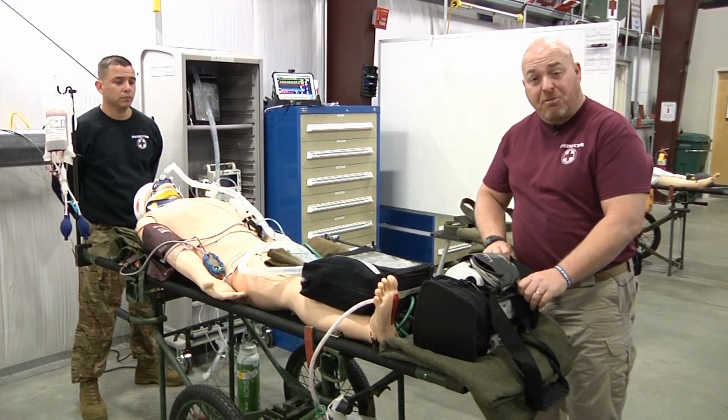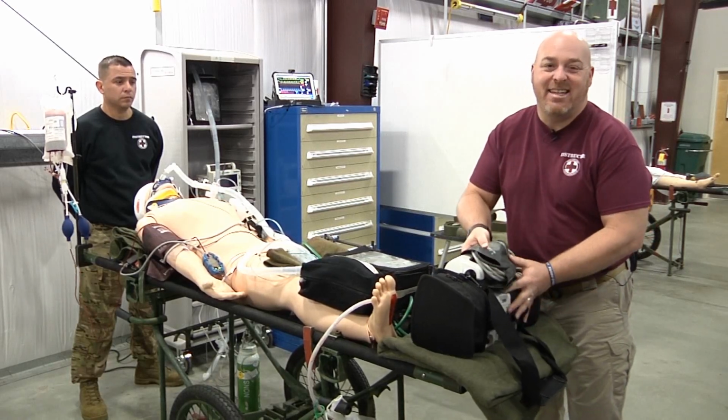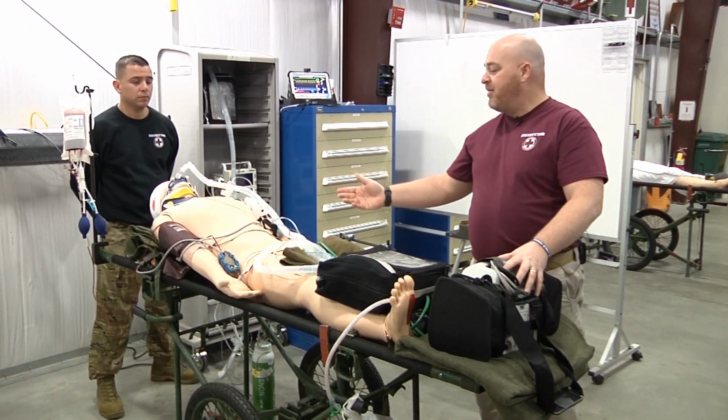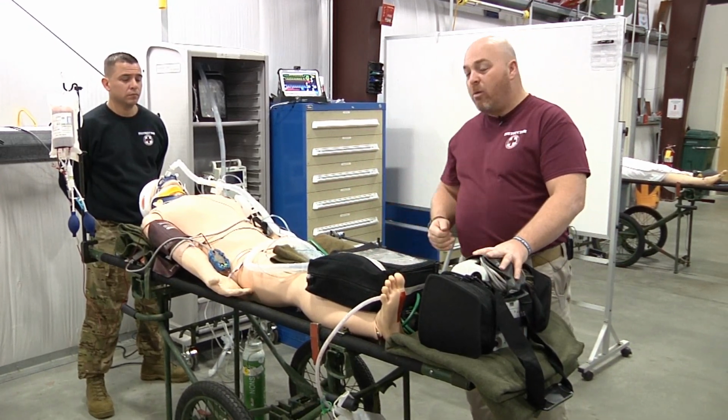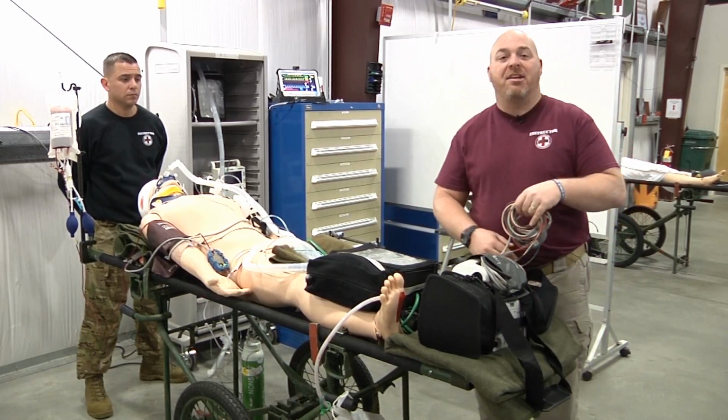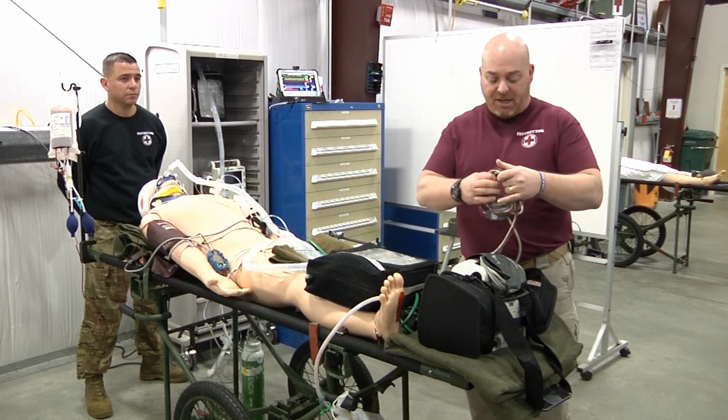Now this is where it becomes very important for you to keep everything as neat and clean as possible. You can see we've already got vent hose running up there. We've got IV fluids running. We've got blood running. We've already got a whole bunch of other wires going up there. So it's extremely important that you try to keep everything as segregated and as neat and clean as possible.